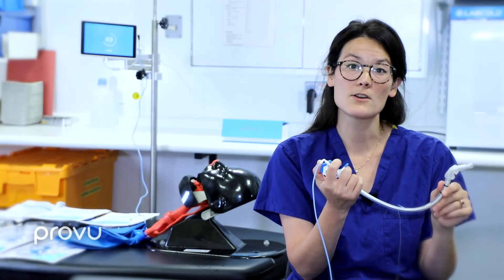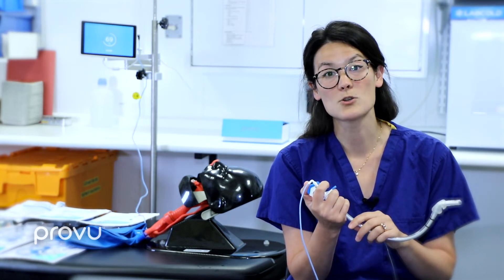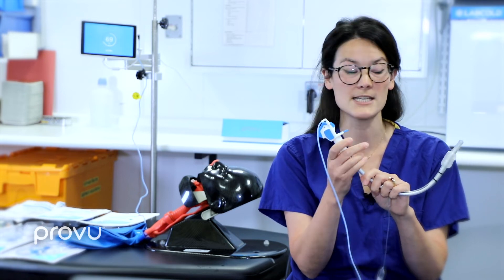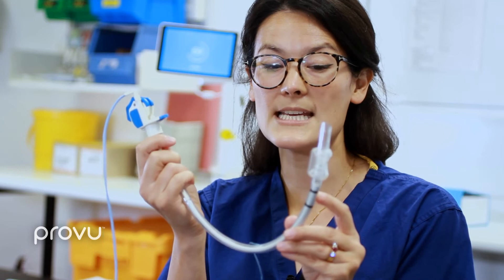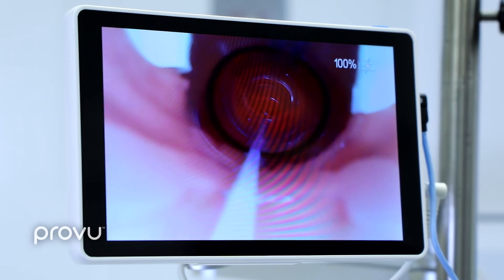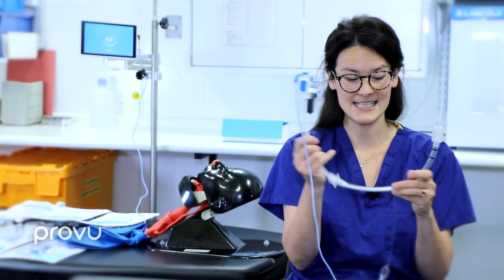Seeing the carina is very important during awake tracheal intubation as it forms one part of our two-point check, along with checking for CO2. Once you've confirmed the carina, you remove the video stilette — and because the video stilette is clear, you can see exactly where the cords are positioned in relation to the two black lines on the tube, ensuring the cuff doesn't sit within the cords and cause damage. Then you remove the stilette.